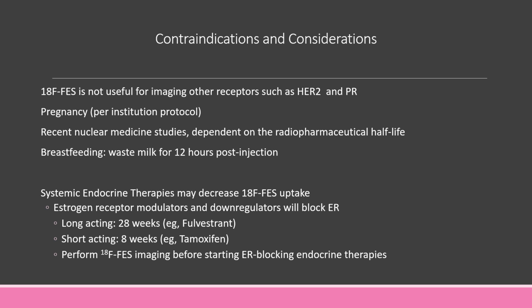Less than 1% of patients who received FES imaging had adverse reactions. Less than 1% reported injection site pain or dysgeusia, which means altered taste. That's also transient, not permanent. So it is recommended not to delay therapy for an FES scan if the patient needs systemic endocrine therapies, but the FES should be done prior to starting those therapies. And then, like I said, if the patient is lactating, that needs to be wasted.